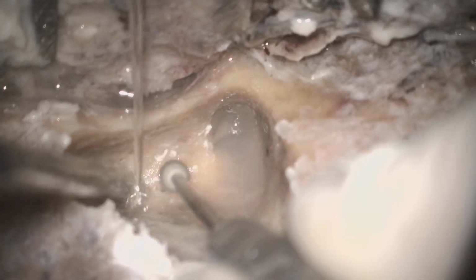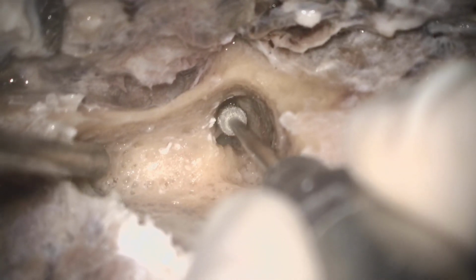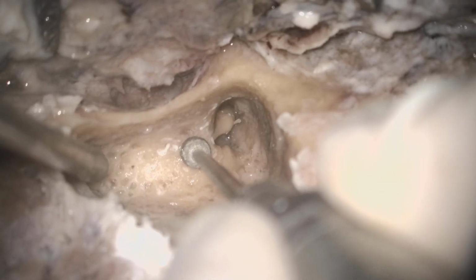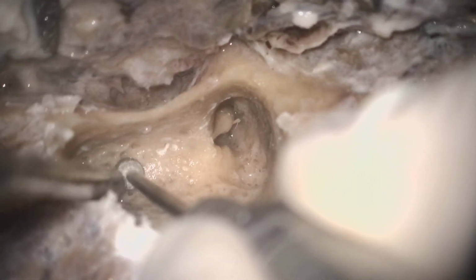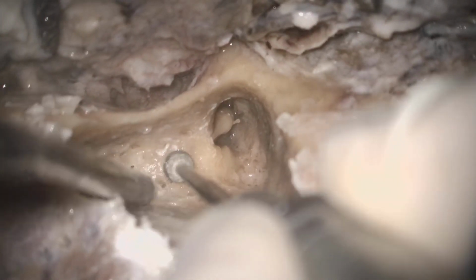Sir, kindly define the bridge and the ridge once again. Look, this is the canal wall. Here is the lateral semicircular canal. The facial nerve will come from the middle ear floor to the mastoid cavity and go along the way up to the digastric ridge. So this thick part lateral to the facial nerve, just below the lateral semicircular canal, this is called the ridge. And the bony part above the scutum area, in that region, this is called the bridge.